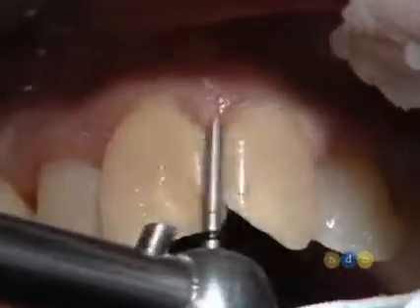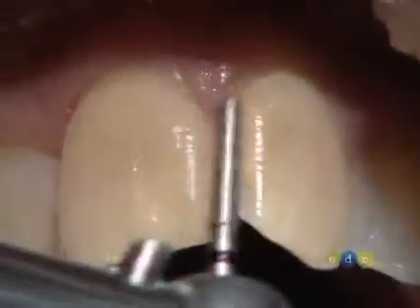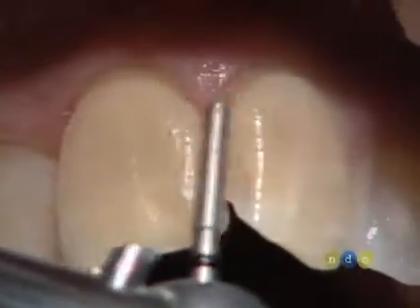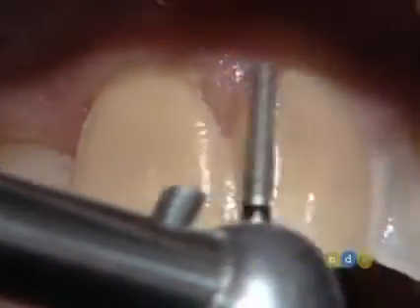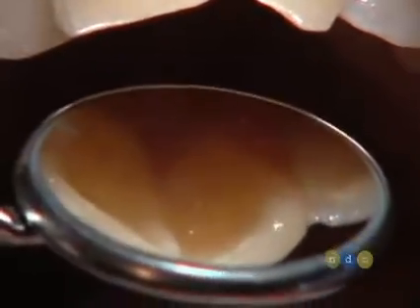We're going to just be flattening this area. We are creating the buccal contour of the final restorations at this point. This will be our buccal contour for the final restoration, or at least the parameter for it. With just a little mirror reflection, we can see that we've created more of a flat profile here.